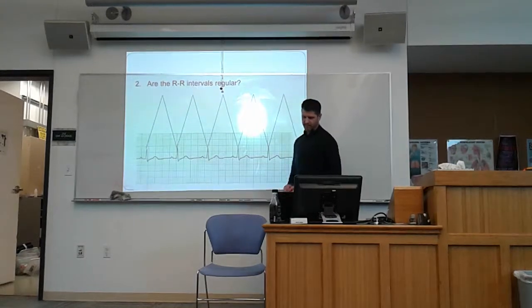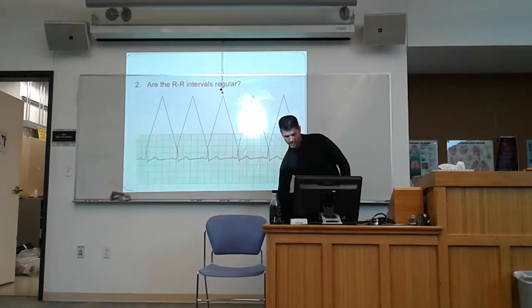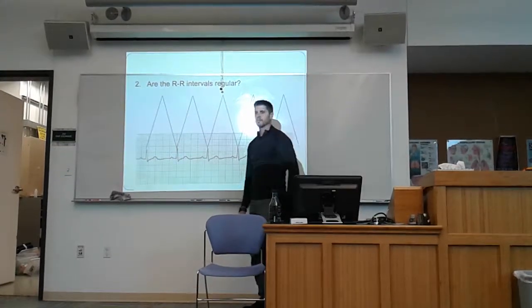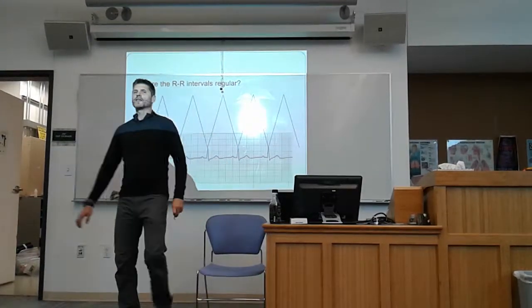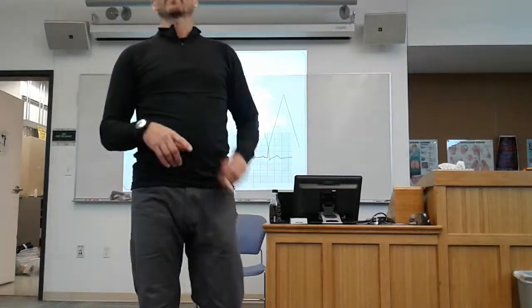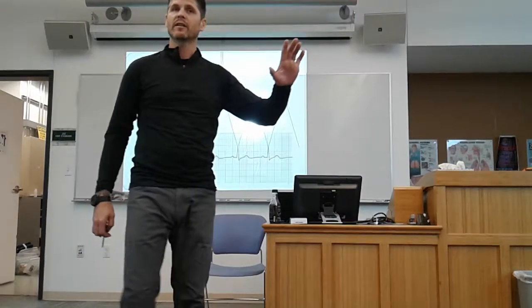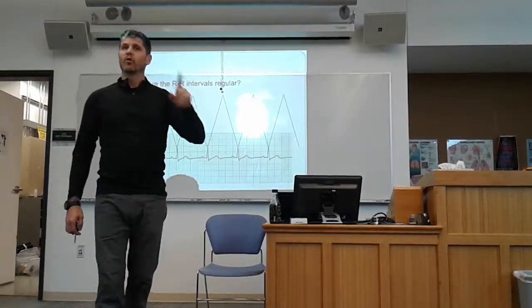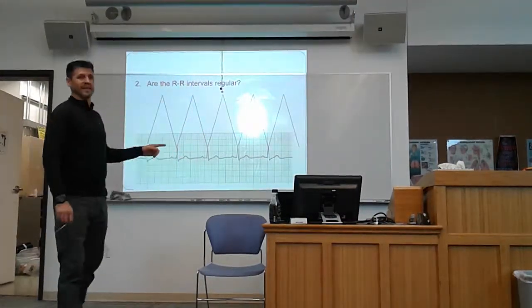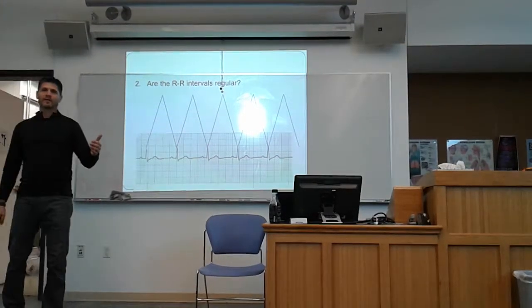Questions on that? Zach, so you wouldn't do T to Ts? Say that again. T to T waves? I'm not interested in T to T or any T wave information just yet because we're going to add that down the road, specifically in our craft area. But what should my T to Ts be if my P to Ps and my R to Rs match? Right? Because my repolarization has to be the same.